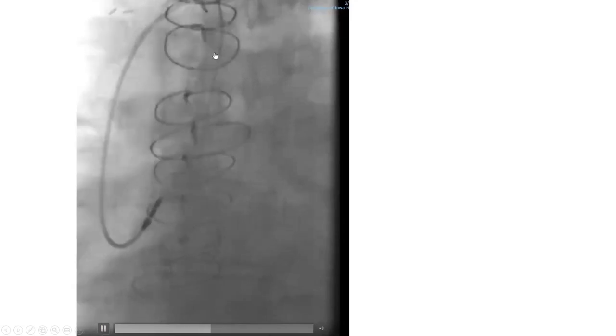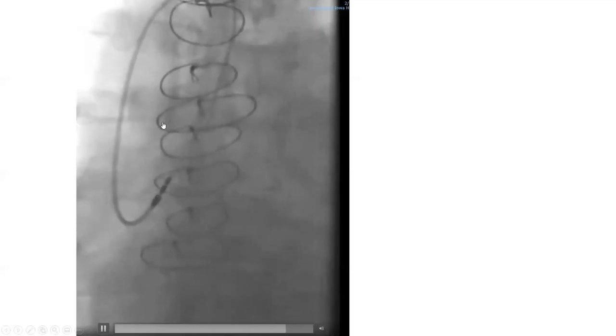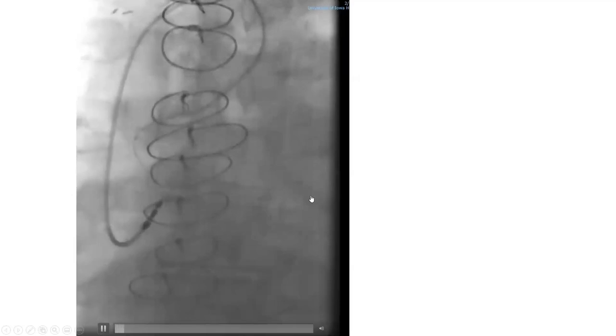Most fellows just shove it — you need to do that torque as you're advancing it. Initially the catheter was shoved and it didn't work. So we asked the patient to take a deep breath. Then the catheter was advanced with a torque maneuver to make it embrace that curvature, and now it's looking toward the left cusp. Whether you're engaging the left or right coronary, your catheter at the beginning should be looking this way. For the left coronary, you'll eventually make it engage the left coronary. For the right coronary, you clockwise torque it. Both ways, your catheter should start in this neutral important position — looking toward the left — then maneuver it to the coronary you want.